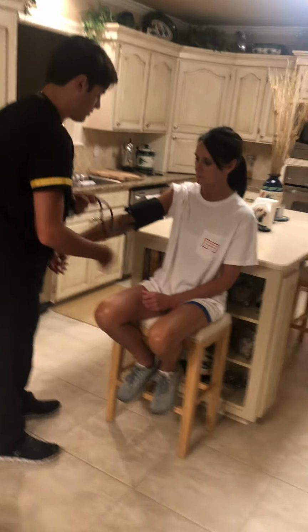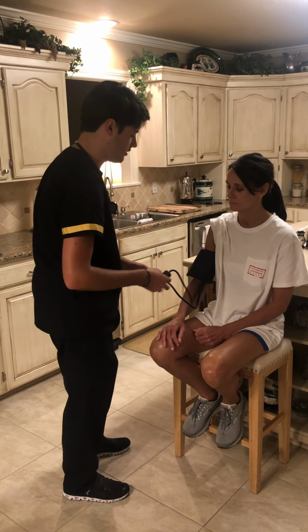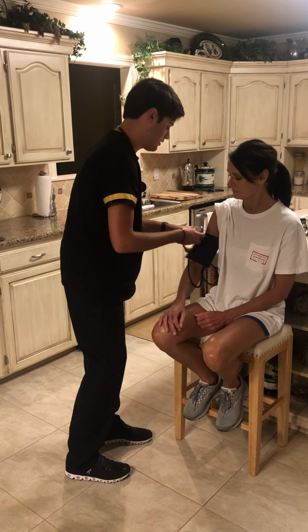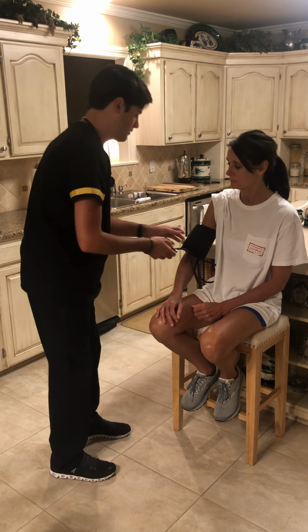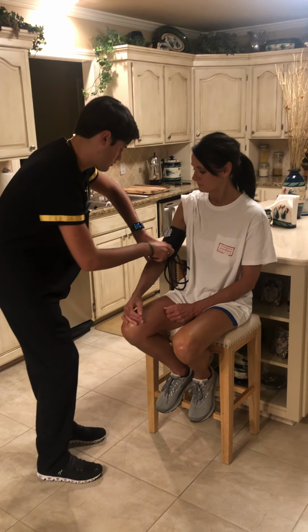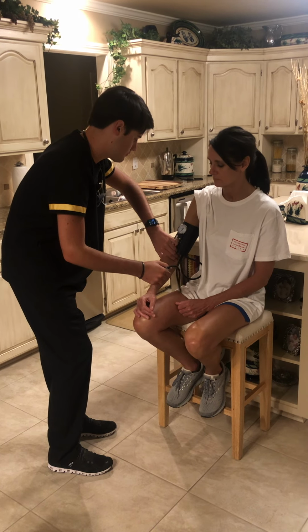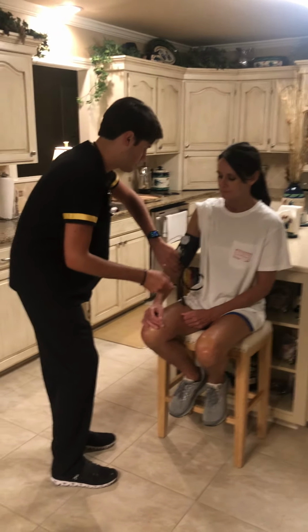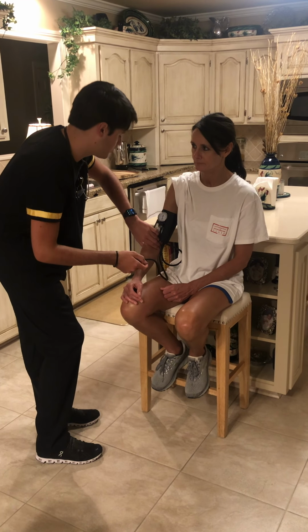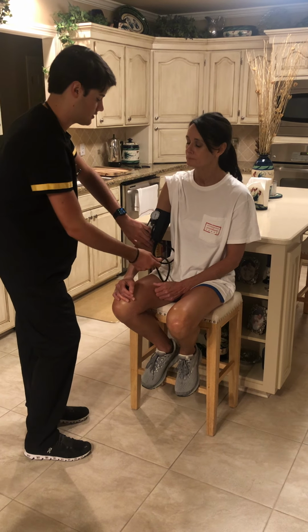So, you relax your arm. First, I'm going to palpate the brachial artery to see to what number I need to pump it up to. Okay. So, it stopped at 110. I'm just going to pump it up to about 130, and I'm going to listen.